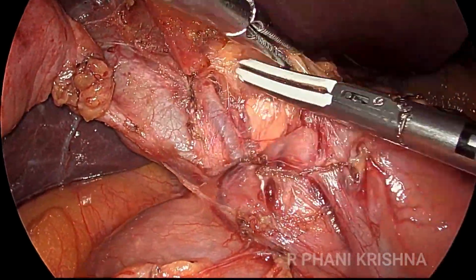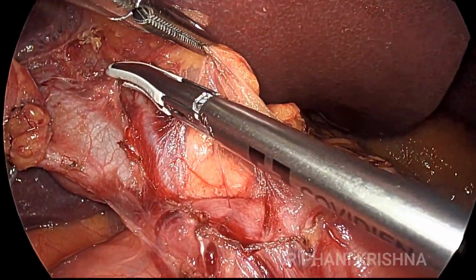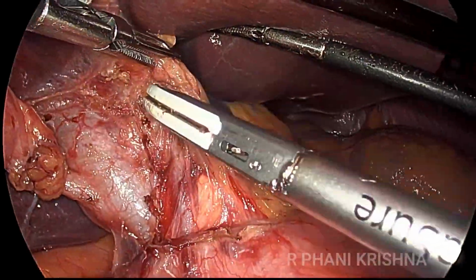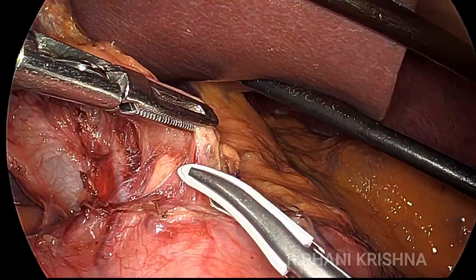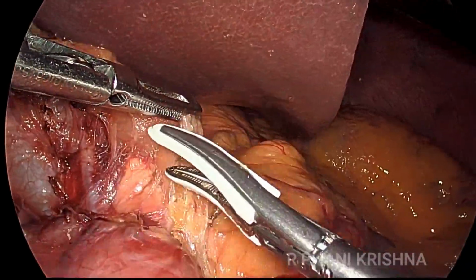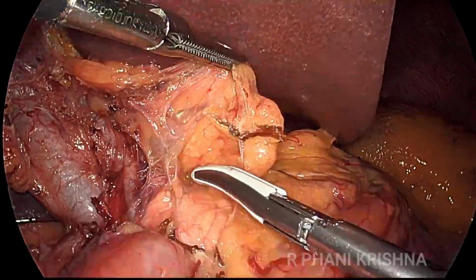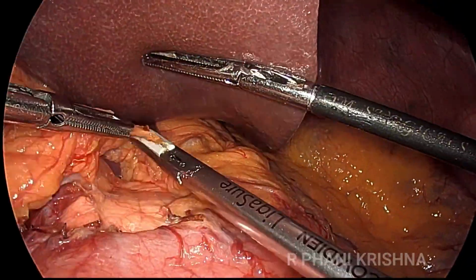And then once we identify a vessel, in this case the GDA, which we are dissecting, or if we take off the common hepatic node, we will identify the common hepatic artery there. And once we identify the artery or the node, that forms the sort of roadmap for our lymphadenectomy. We travel on the surface of the vessel and clear out all the lymphatic tissue, and walking on the vessel is the most efficient way to do the lymphadenectomy.